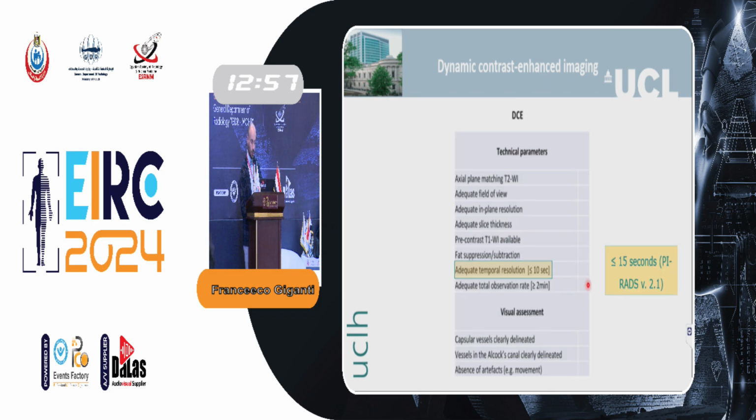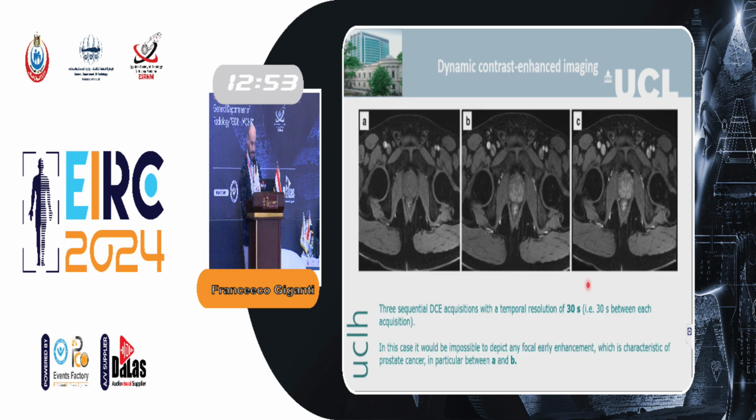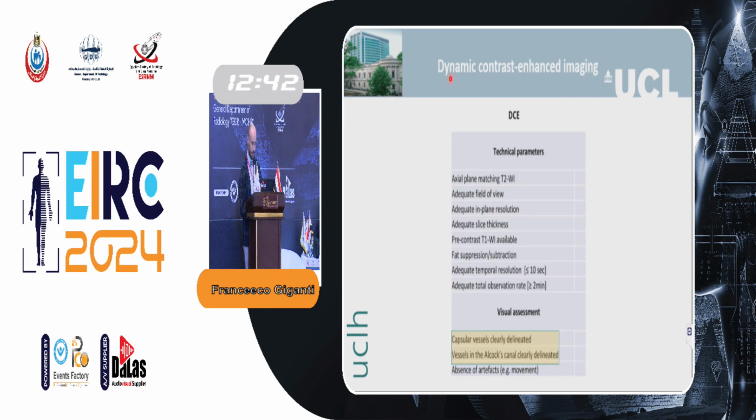The temporal resolution should be 15 seconds for PI-RADS version 2.1 guidelines. In this case, we have a temporal resolution of 30 seconds, which is not adequate because we are not able to see the tumor that has an early wash-in and an early wash-out.